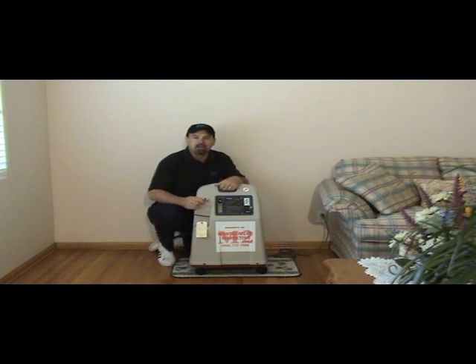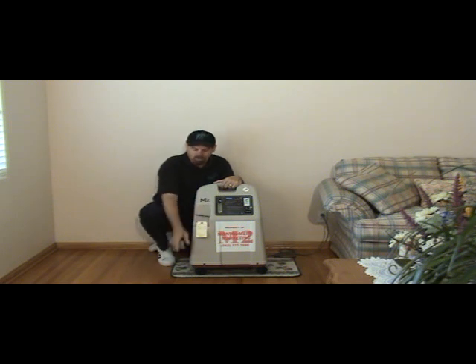Secondarily, if you're working in an area that has hardwood floors like this one or a tile floor, the vibration can cause excessive noise, or at least more noise than you want to provide. If you are working with a hardwood floor, if it's not on a carpet, then try to find a rug like the one that we have here to go underneath the concentrator. That will eliminate, or at least reduce, some of the noise levels.